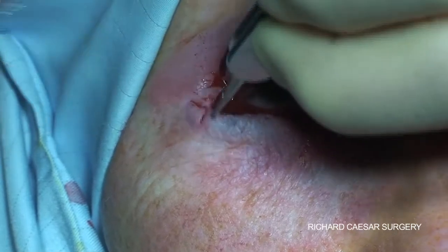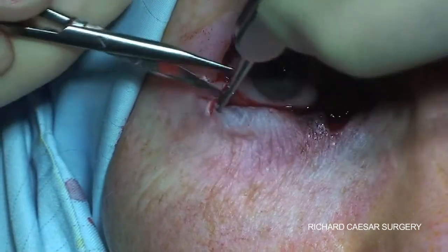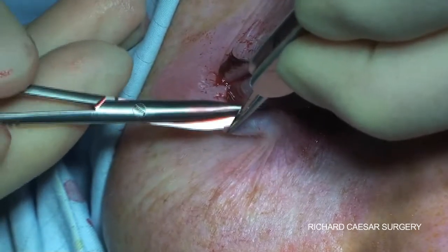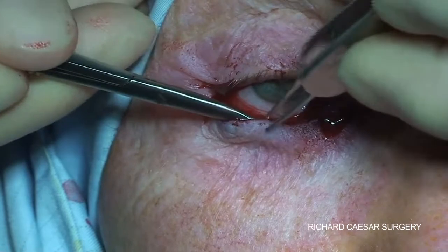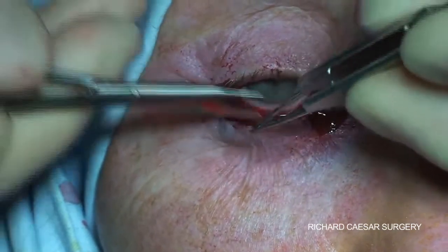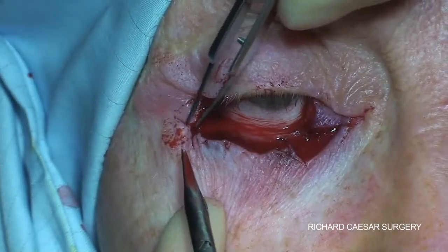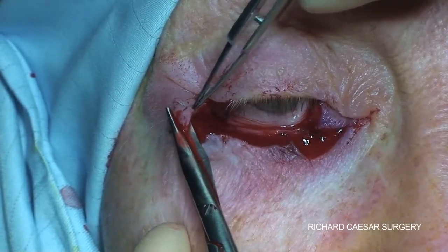The spring scissors are ideal for undermining, and the plane you want to be in is subdermal and anterior to the orbicularis, as it's only the skin you need to advance. Once you're in this plane it's very easy to advance the scissors. If you trip into the orbicularis you simply tend to cause a fair bit of bleeding and subsequent bruising. This undermining continues on both sides, the second Burow's triangle is trimmed off, and the skin flap is then ready to be advanced.